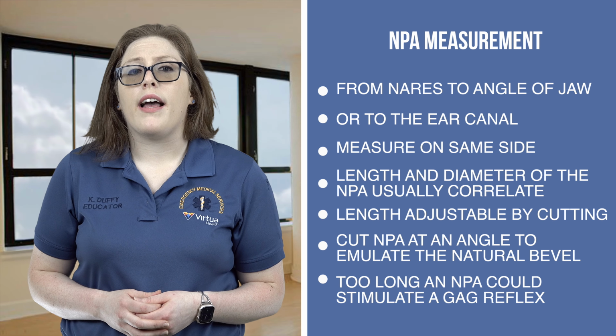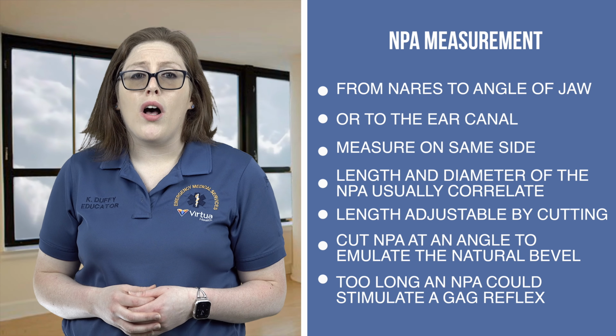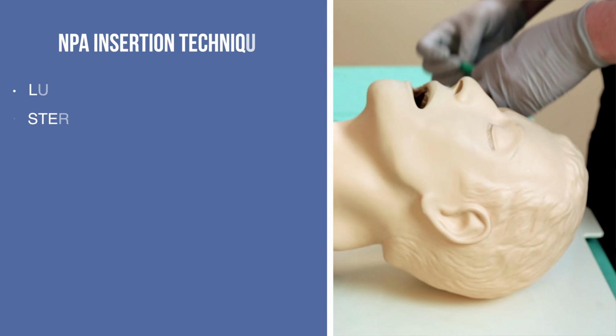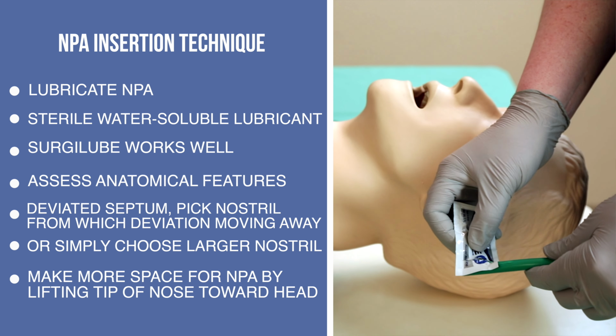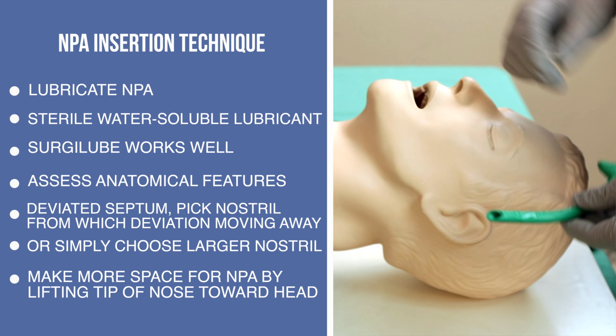It is better to have too short a nasal airway. If a nasal airway is too long, it could stimulate a gag reflex. This next part is crucial. After completing the measurement, lubricate the airway with a sterile, water-soluble lubricant like Surgilube.